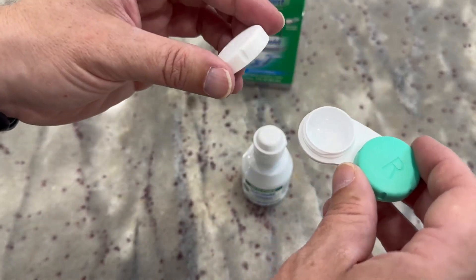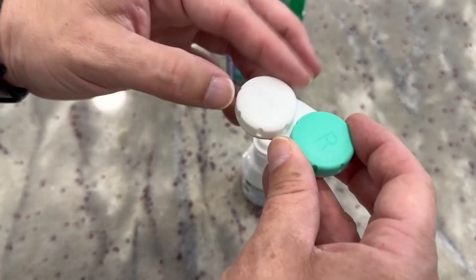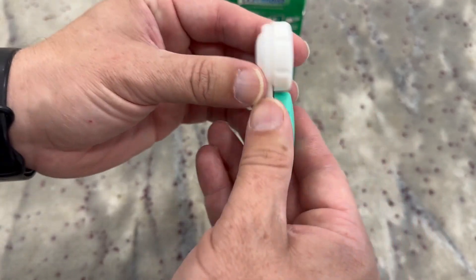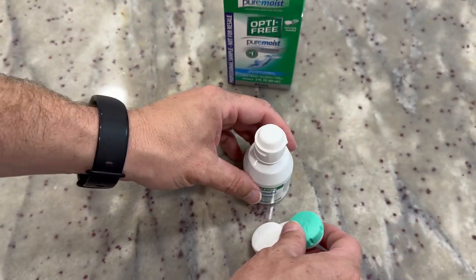I like this particular case. As I open it up to show you, it tightens down and keeps things nice and closed up in there, so you're not going to leak if you tip it over — the solution is not going to drip out or anything.